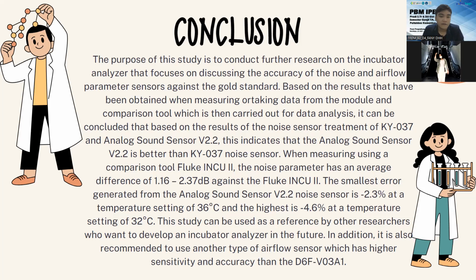The smallest error generated from the analog sound sensor V2.2 noise sensor is minus 2.3% at a temperature setting of 36 degrees Celsius, and the highest is minus 4.6% at a temperature setting of 32 degrees Celsius. This study can be used as a reference by other researchers who want to develop an incubator analyzer in the future. In addition, it is also recommended to use another type of airflow sensor which has higher sensitivity and accuracy than the D6F-V03A1.